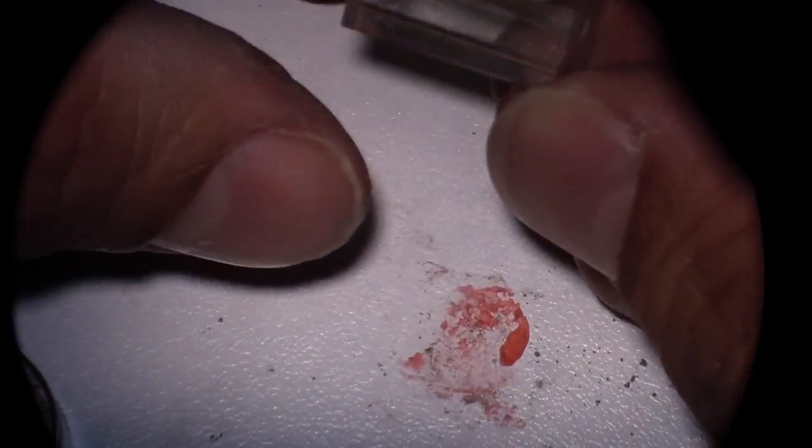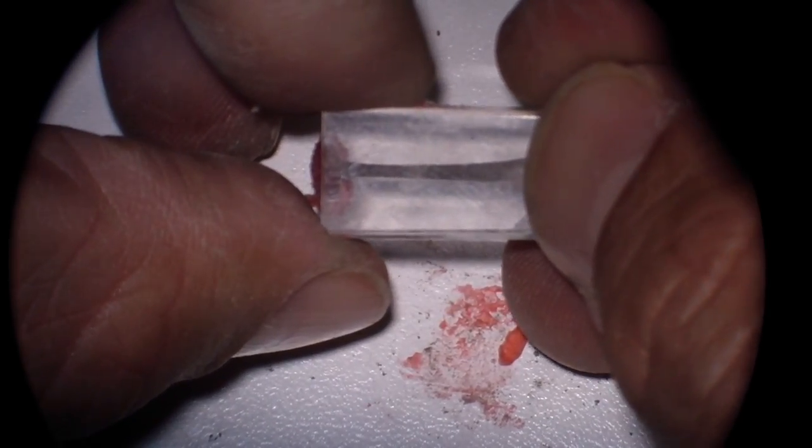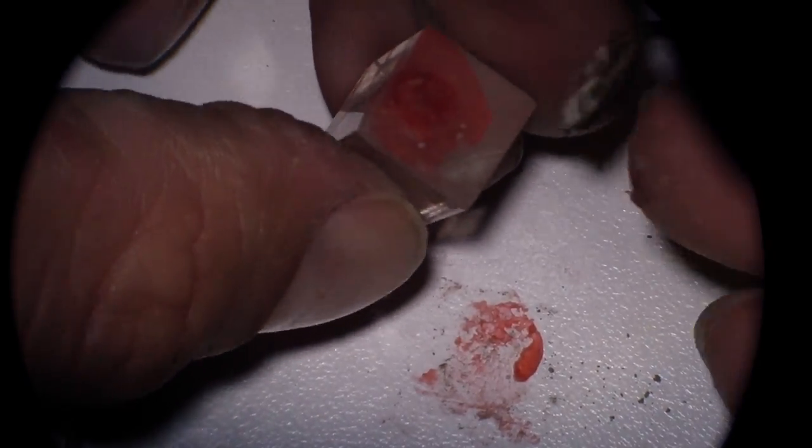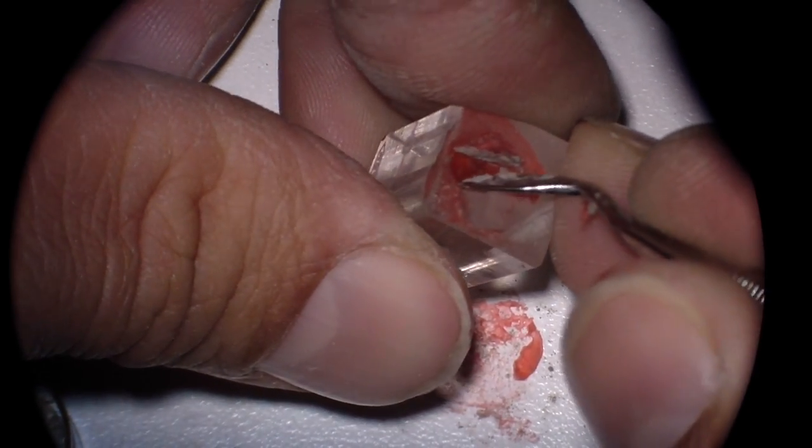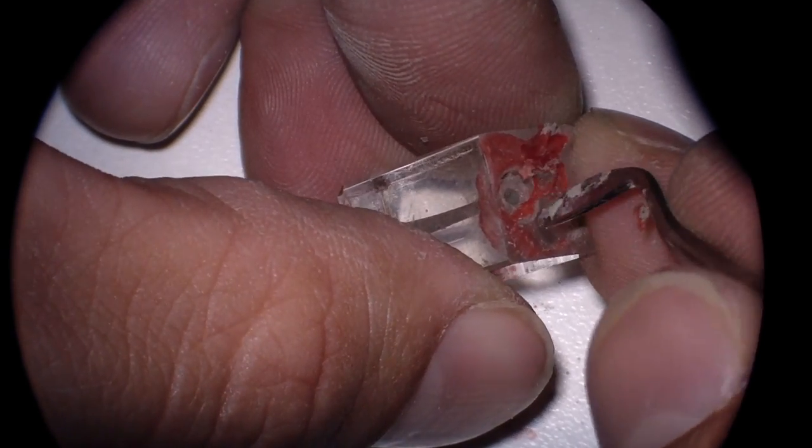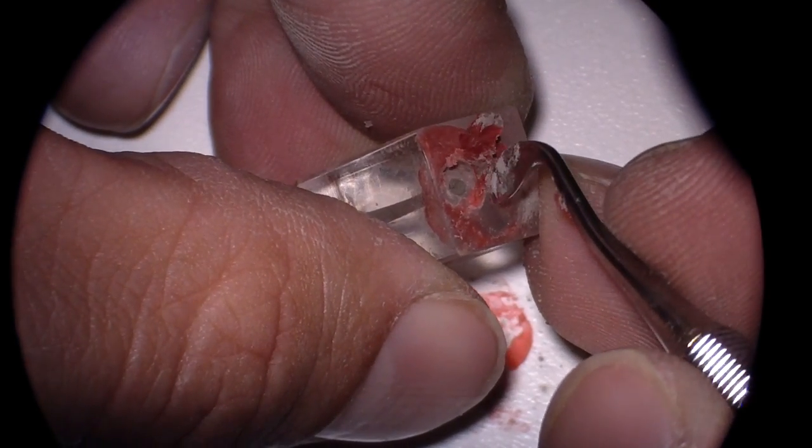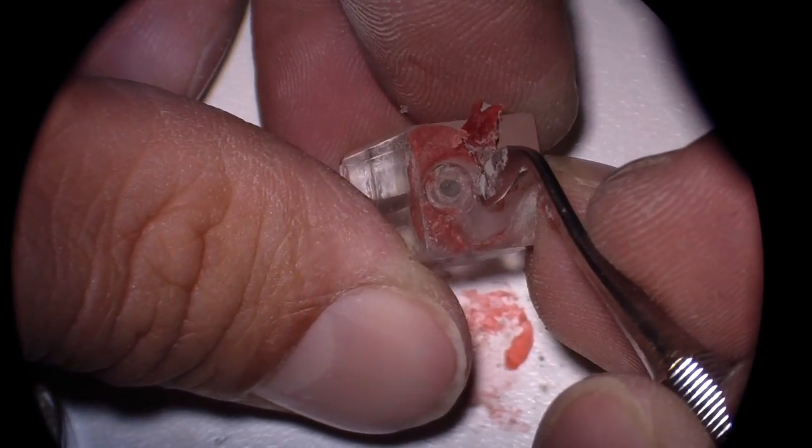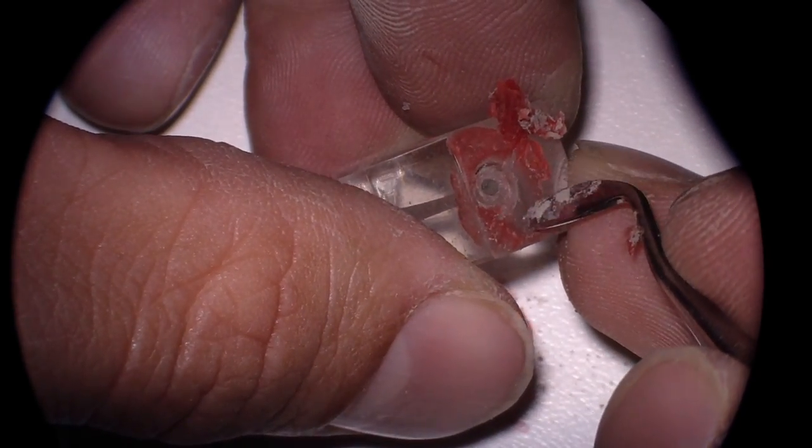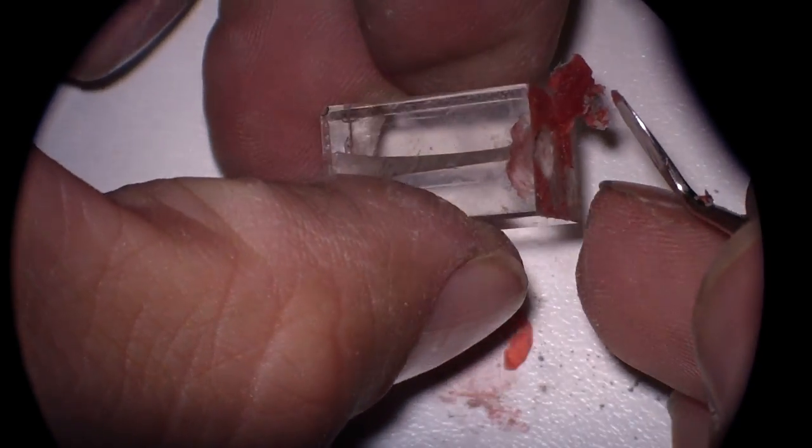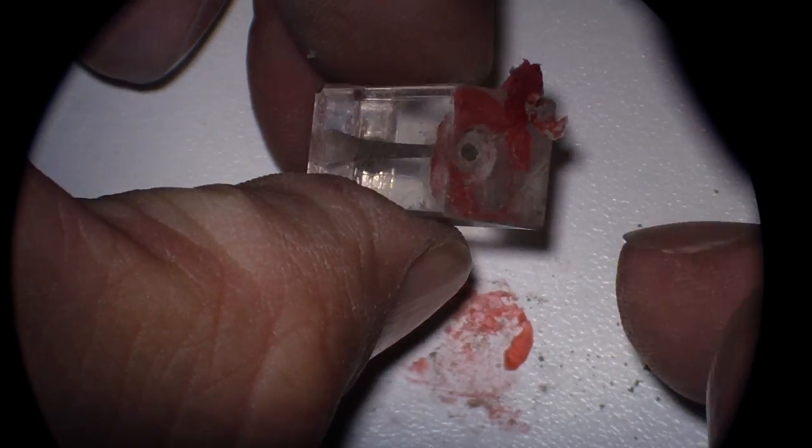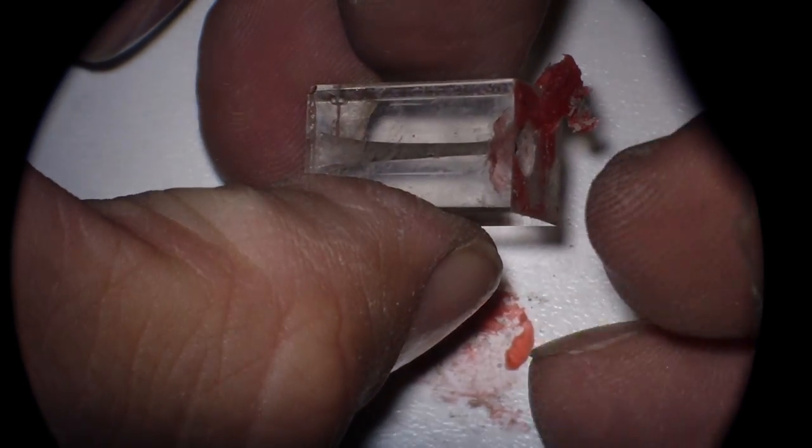So at this point I'll probably switch to using my condenser. And using the ultrasonic instrumentation, you can do that when you're as far down as you want, just to make sure you get a dense fill. Okay, so again, I've finished. I've now obturated to the most coronal portion here. We're going to take a radiograph, and let's just see the end. We'll take off the wax plug. And you can see now we have what appears to be a dense apical plug. From here we can either, depending on what the situation is, whether you're going to resect, leave this, or try to create an apical barrier. I hope this helps. Cheers.